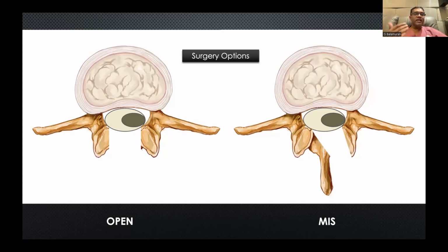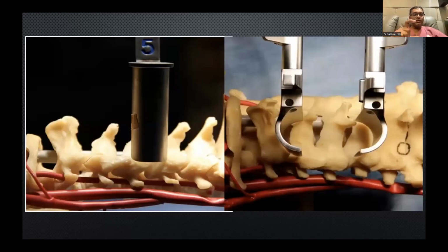And so you need to select the side of the approach based on the side of the pathology, or if it is a midline tumor, you can go from the left-hand side for a right-handed surgeon. So as I said, you can use either a small, fixed tube, which I use for small schwannomas, small meningiomas, up to 22 or 26 millimeter ports, or you can go for an expandable, where up to 3 levels you can remove this.